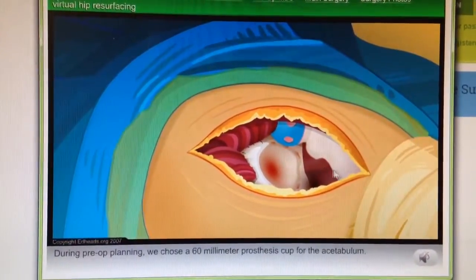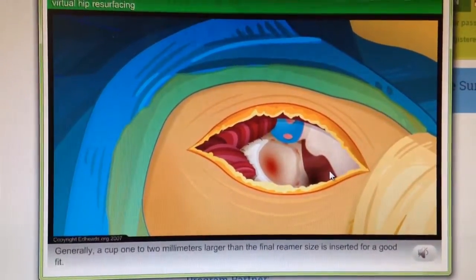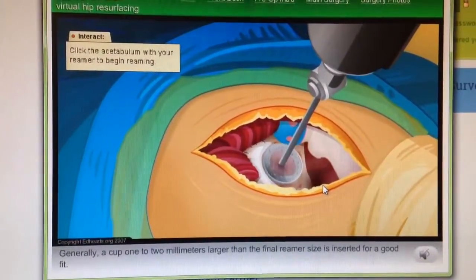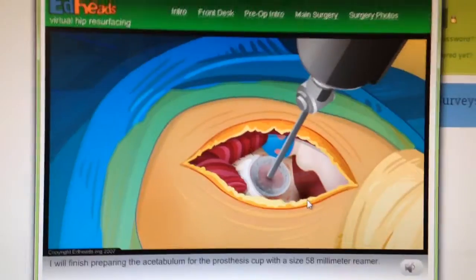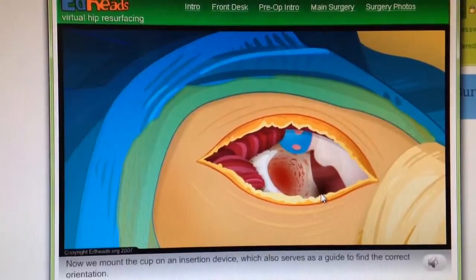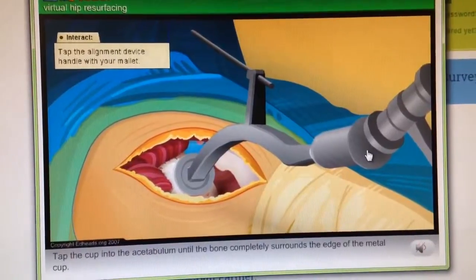During pre-op planning, we chose a 60mm prosthesis cup for the acetabulum. We will need to gradually increase our reamer size to prepare the cup for the right component. Generally, a cup one to two millimeters larger than the final reamer size is inserted for a good fit. I will finish preparing the acetabulum for the prosthesis cup with a size 58mm reamer. Now we mount the cup on an insertion device, which also serves as a guide to help find the correct orientation. Align the device with the lines shown. Tap the cup into the acetabulum until the bone completely surrounds the edge of the metal cup.